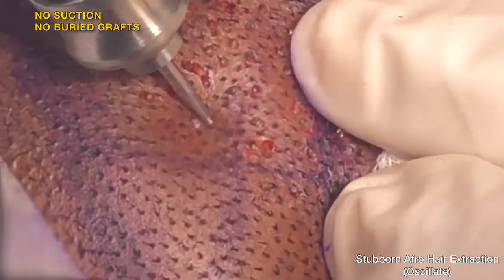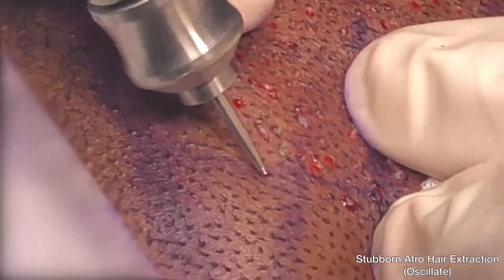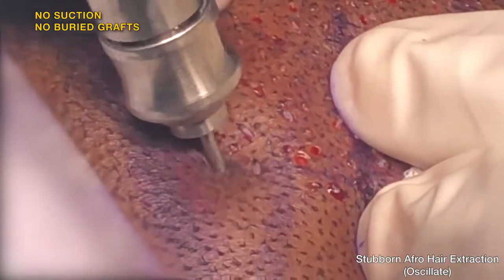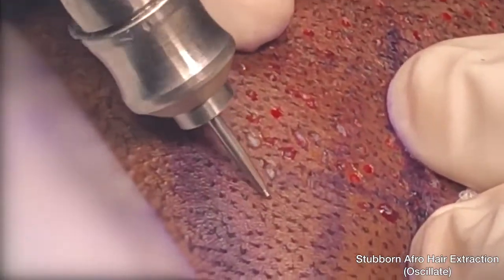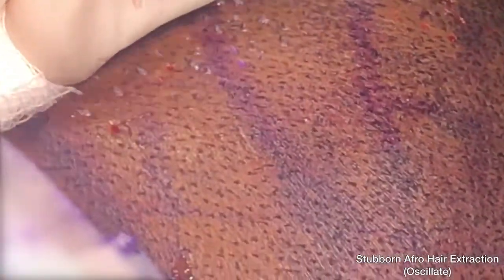All one needs to do is aim, touch the skin and move. With the FUE swipe maneuver, 50% of the job is done right there.